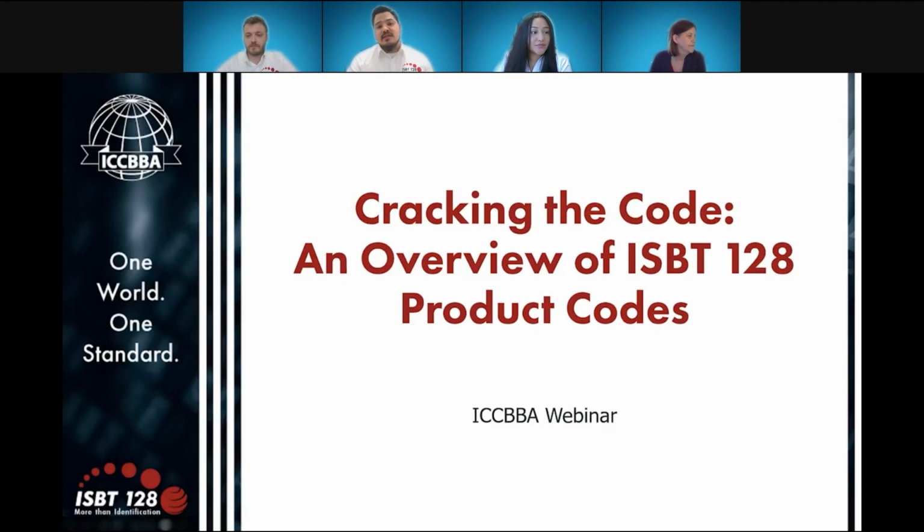But if the facility wishes not to provide any information, such as with some common ones like capitalized V for volunteer, they can use the element 0, which means null or not specified. This differs for MPHO types because tissue doesn't use that 6th character to identify type of collection, so it wouldn't be necessary there.